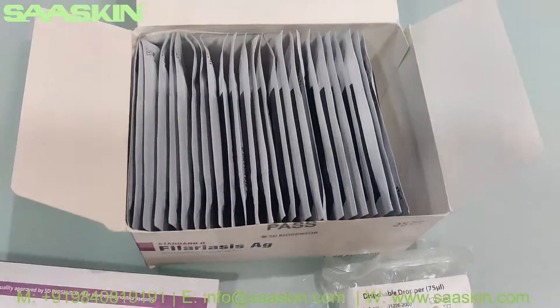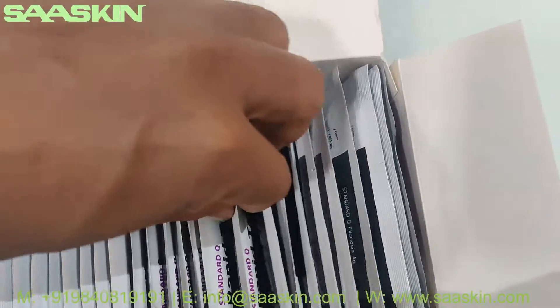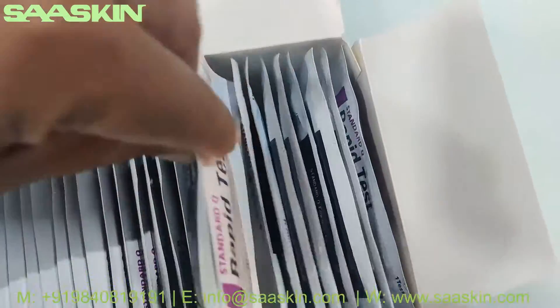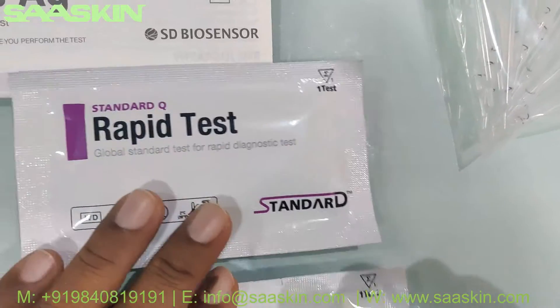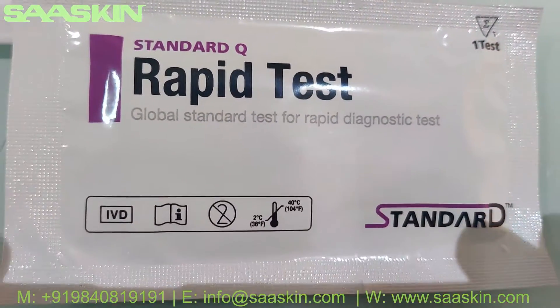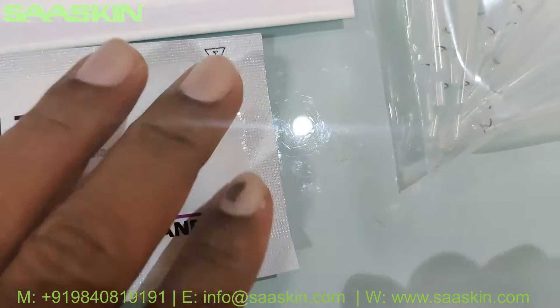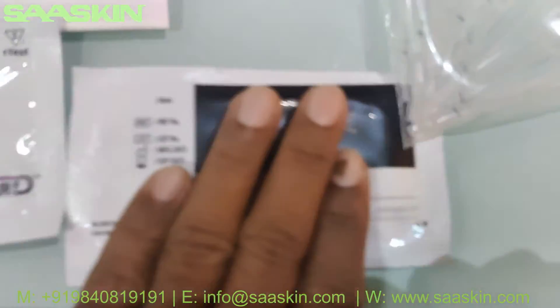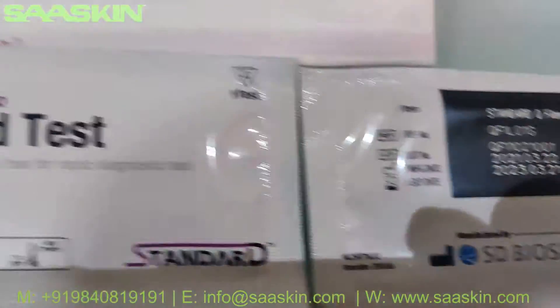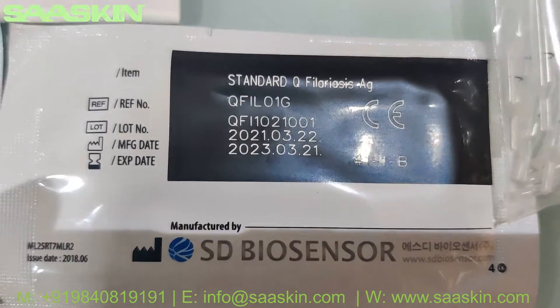You also have the test cassettes — there are 25 test cassettes in this box. This is how the test cassettes look like. The front side and the other side look like this.